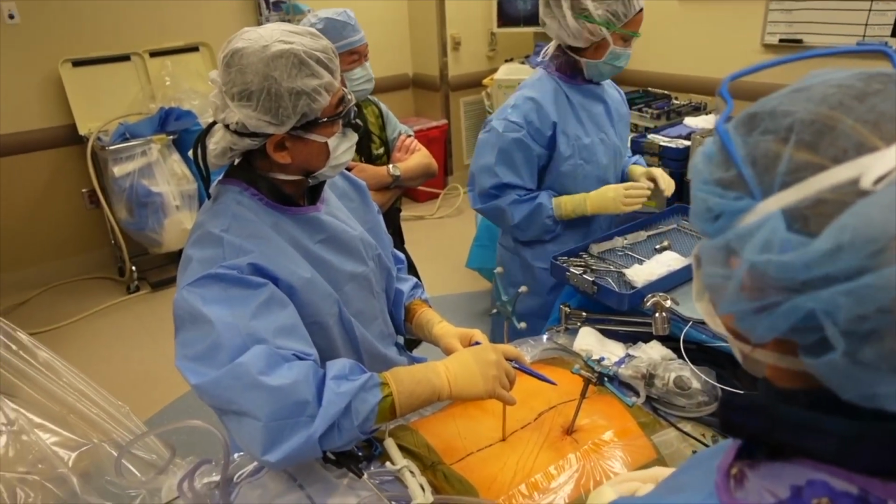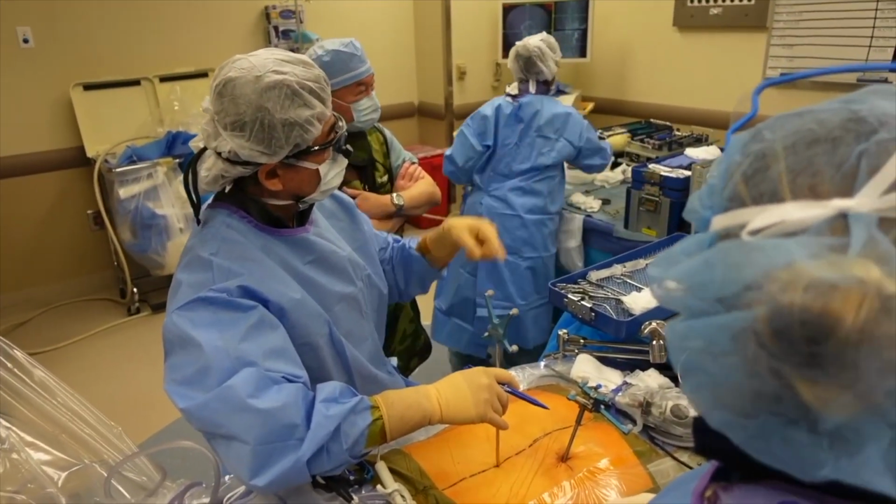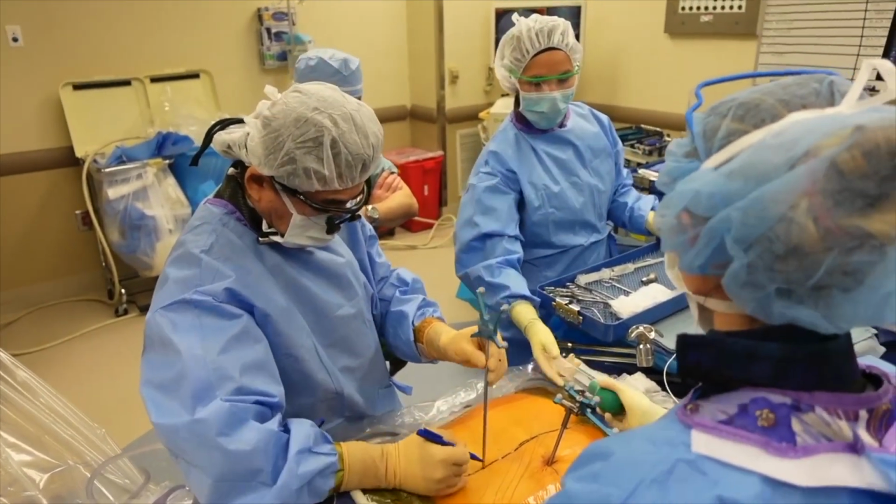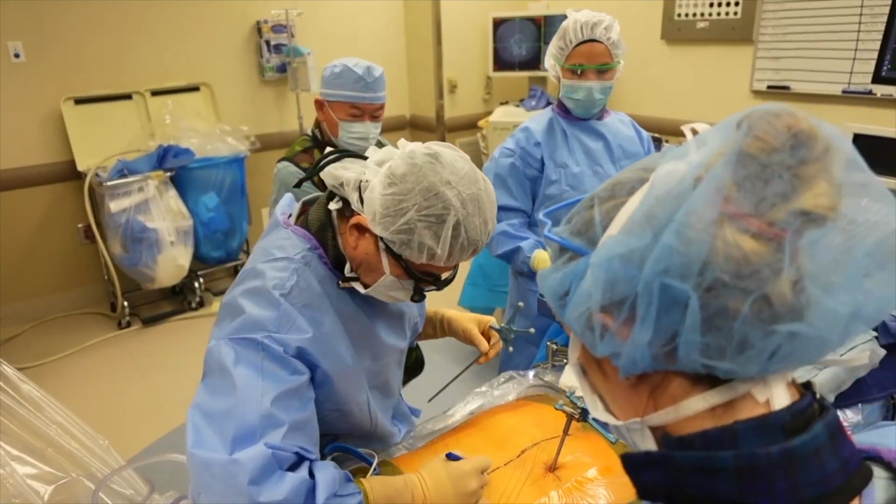I use all these lines for a variety of things. So now I want to basically identify the bullseye to the L3-4 disc space. That's right here. Now I make this line really long.